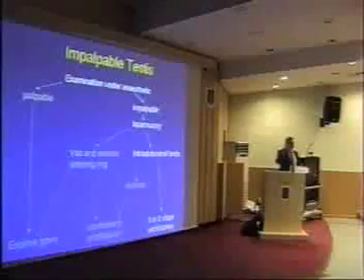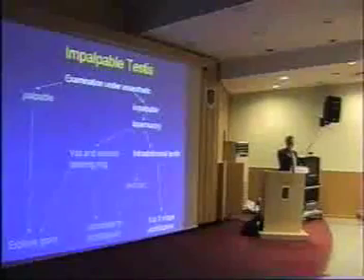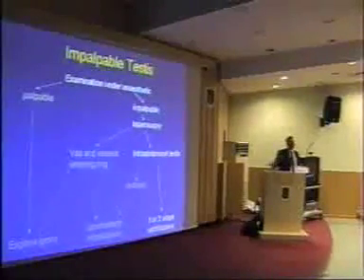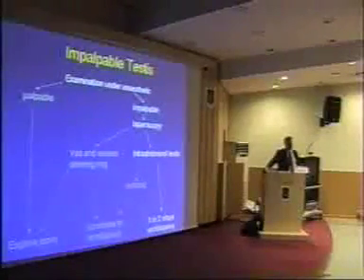It's in front. You come down on the back of the kidney, you see the ureter, and behind the ureter, or rather should I say in front of the ureter, are the vessels you lifted up, there they are. And you get a very good view. In a child, you have very much a space to work in.